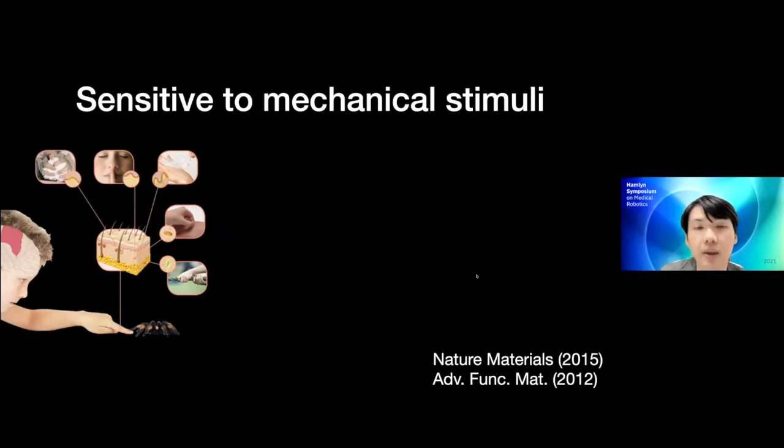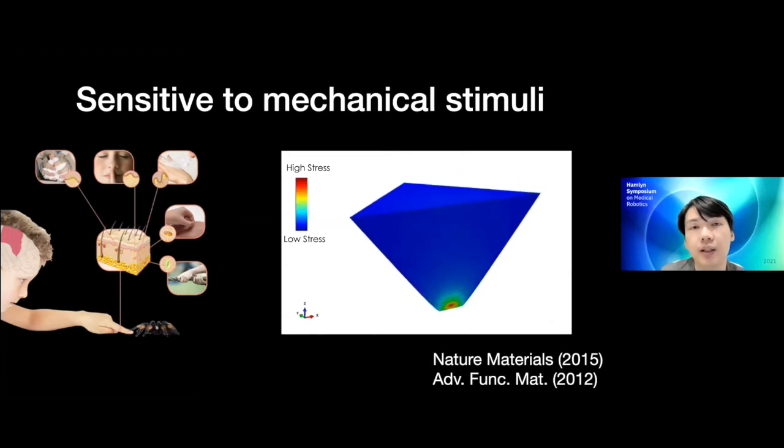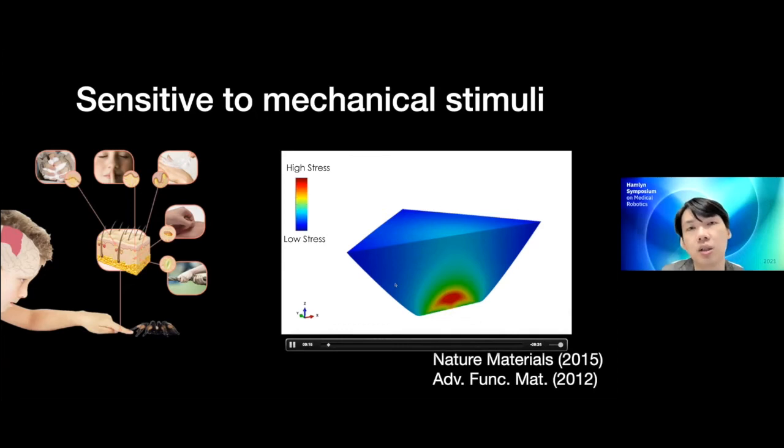And so looking at mechanics of materials, we can design them to be more sensitive than they are by structuring them. Using soft materials gives us an advantage because they can be a lot easier to shape or mold, through techniques such as soft lithography or injection molding. And so we can mold shapes such as pyramids, and we can concentrate stress at very specific areas so that we can allow the strain to be enhanced, right?